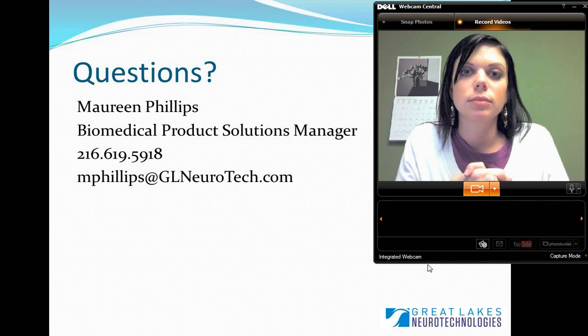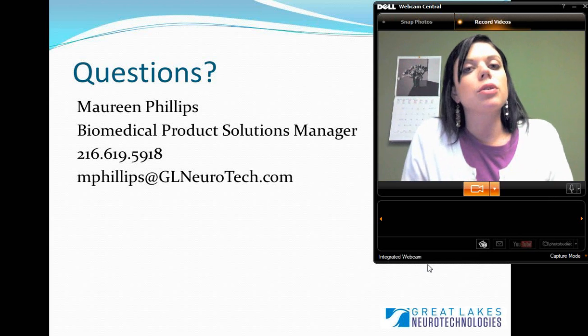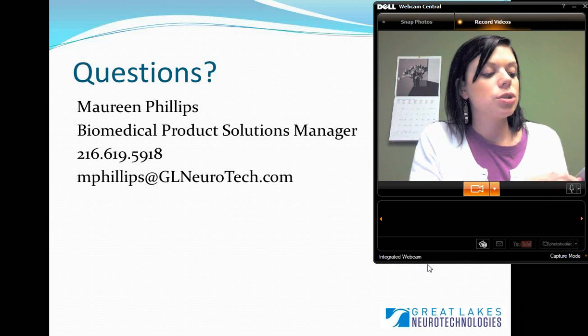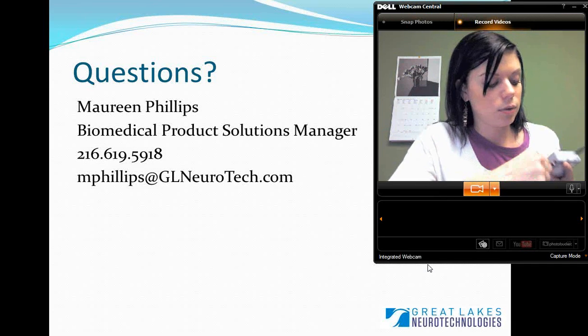Is it possible to plug a peripheral oxygen measurement sensor into the BioRadio, and has that been developed or tested? You can integrate custom sensors with the BioRadio. As I mentioned, the 8 channels, let me grab the device here real quick.